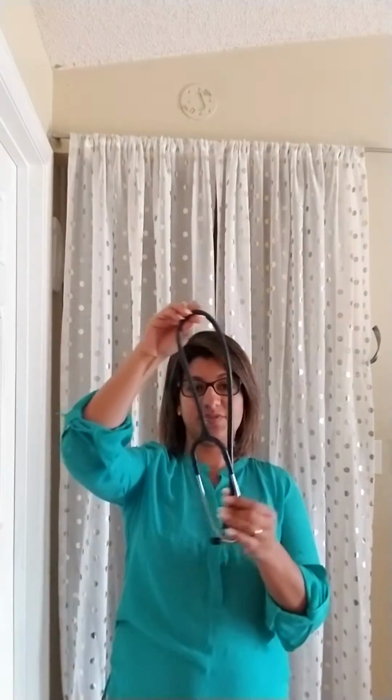And then another main thing that the stethoscope is used for is actually to listen to your bowel sounds. There's actually 4 different quadrants that they'll listen to. And that's very important to hear, so that way they make sure there is movement going on in the GI tract. So the stethoscope is very widely used for that.